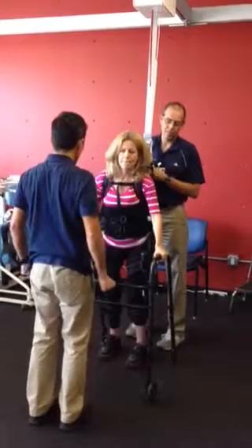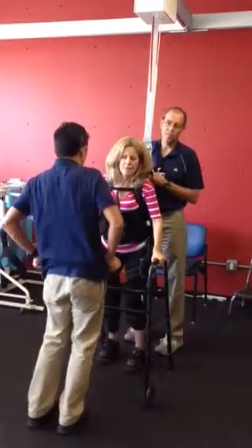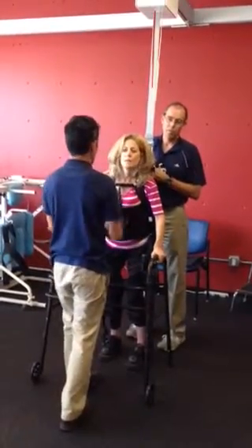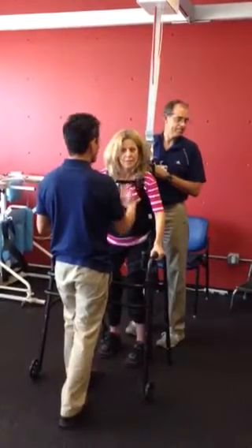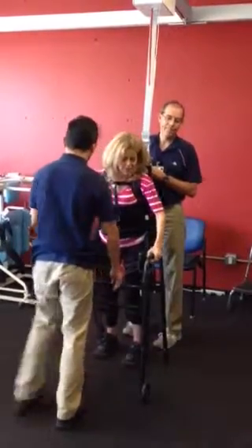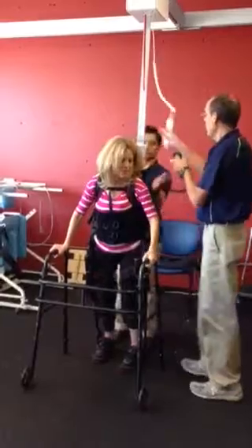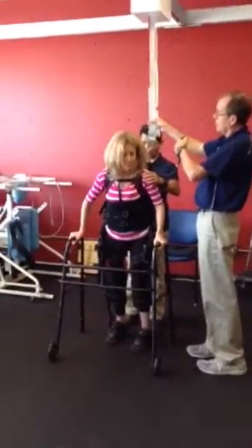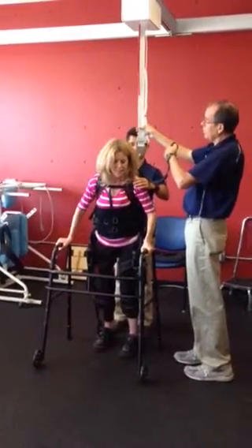Have you ever done a dip? We do the same thing on this so we can monitor the right side. Because whenever we start, we have to do this. Let's do another side. There we go. So when we're ready, the machine is ready. I've got you. It's always going to be the right leg — and we stop.